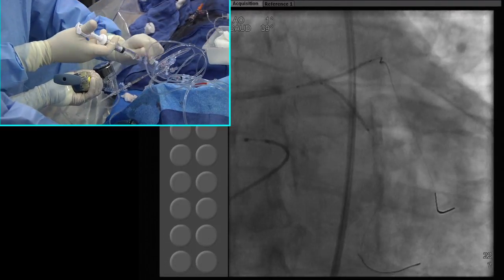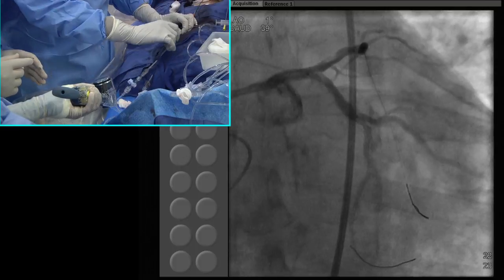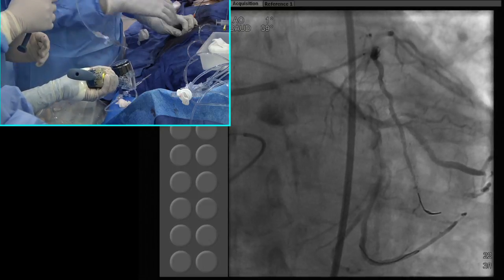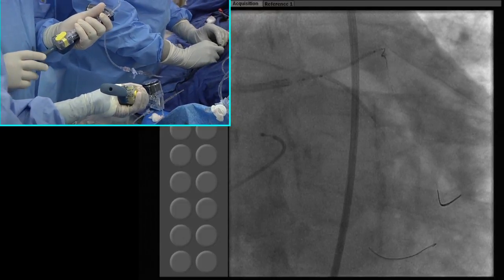We see. Come back a little, 16. With the circ? That's okay. No, circ 16 would have been okay. No, that's okay. It's still okay. You can pull back 1 millimeter. No, circ you have to pull back 1 millimeter, and then we are ready to go. Who has circ? This is the circ. Yeah. Pull back 1 millimeter, and we are okay to deploy. This is fine. Ready? Okay.